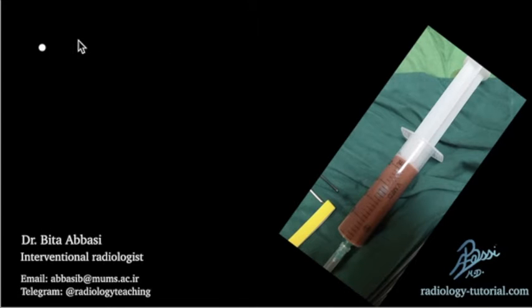I admitted the patient for a core needle biopsy, thinking that I would be dealing with a mucinous cystic neoplasm. In order to prevent peritoneal seeding, I used the coaxial system to aspirate the fluid, and the cyst returned this type of bloody turbid fluid, that is something that I don't usually expect to see in MCNs.